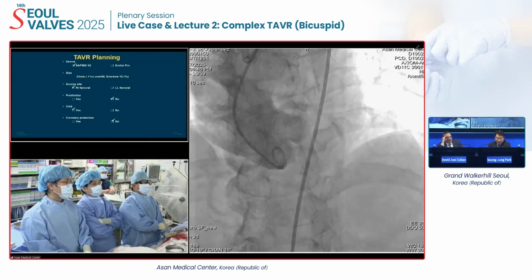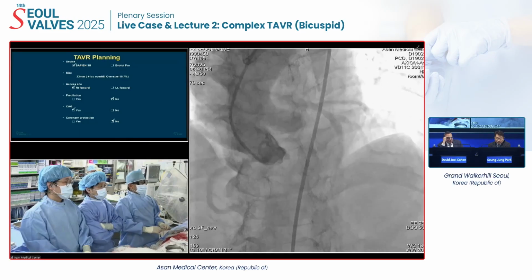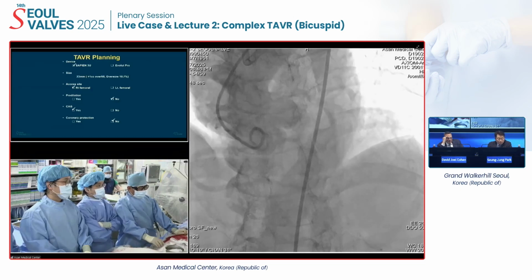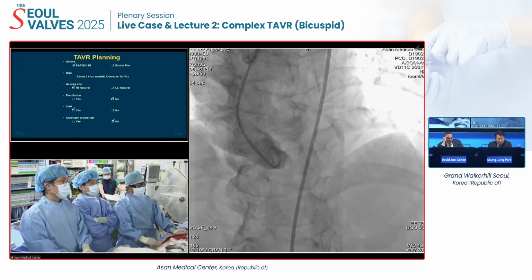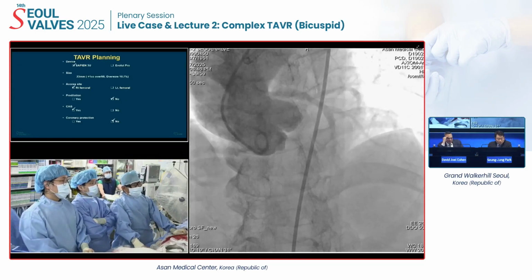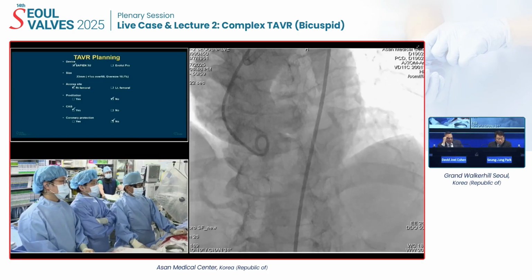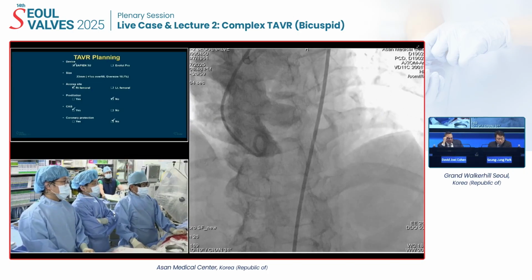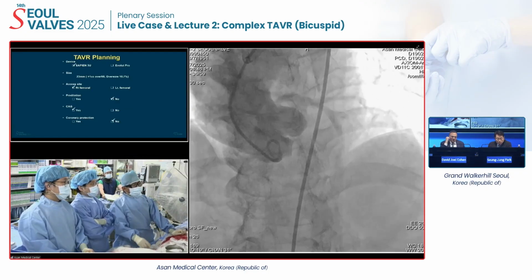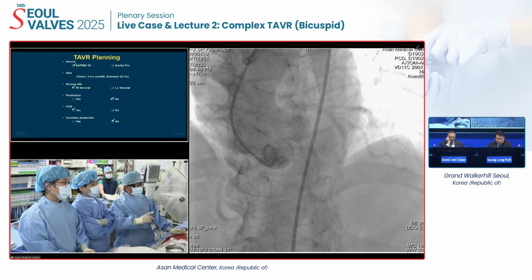The original studies out of Cedars suggested that type 0 valves were not the best for TAVR. What are your thoughts about type 0? Based on the literature regarding peri-procedural complications, type 1 bicuspid has a higher risk of peri-procedural complication than the type 0 bicuspid valve. Particularly the very low calcification type 0, I think could be ideal for TAVR. But maybe the problem is the wire crossing through the valve is sometimes difficult in this case.